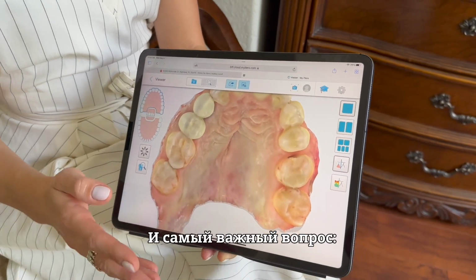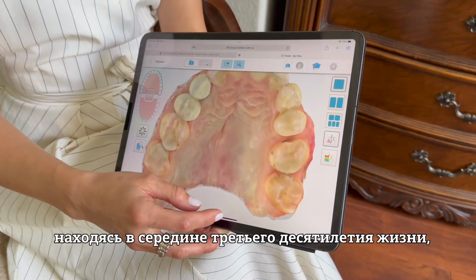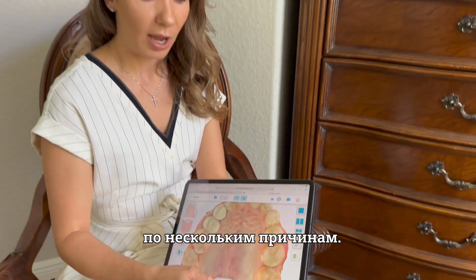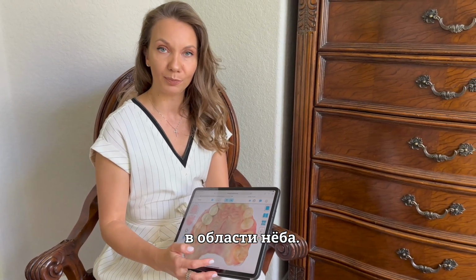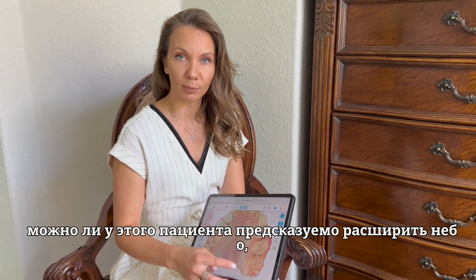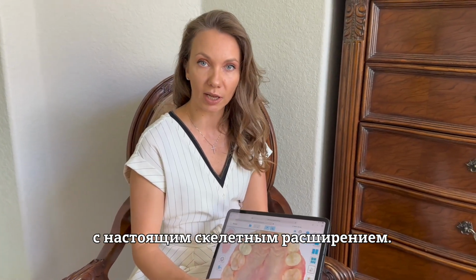And the best question and the most important question, will MSE fit in this patient? This patient, having that she is in her mid-30s, is not a good candidate for the MSE for several reasons. First of all, she doesn't have enough bone support in the palatal area. The second thing that bothers me most is, will this patient predictably open? Won't I have some molar movement instead of having her palate opening with a true skeletal expansion?